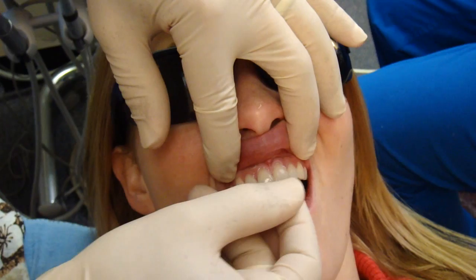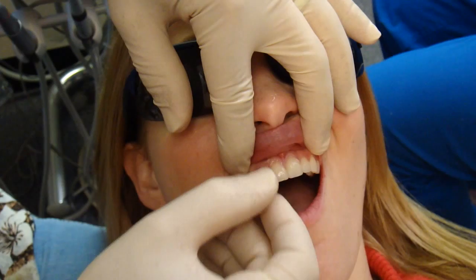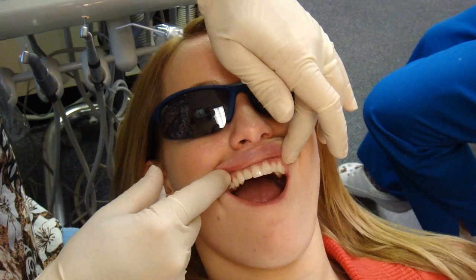Okay, we're going to rinse a little bit. We've got some try-in paste under them, so it'll show you exactly what color they will look like after they're bonded. Let's rinse that off, or I'll wipe them. All right, those fit perfect.